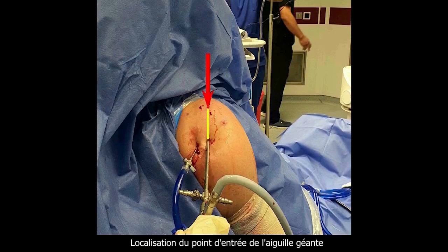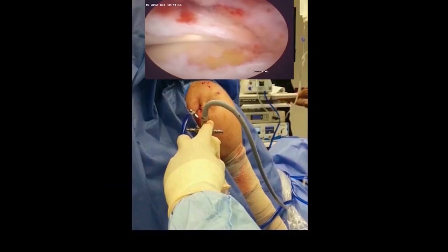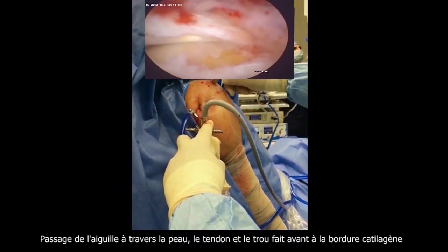Now, after placing the anterior end of the 30 degrees arthroscope at the giant needle entry hole at the junction between the cartilaginous head and the footprint area, imagine a continuation of the scope on the skin as seen in yellow, and place the giant needle immediately through the skin anterior to the acromion as seen by the red arrow, in order to have the tip of the needle immediately anterior to the scope above the hole made by the awl in the bone.